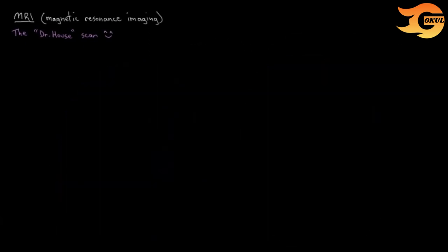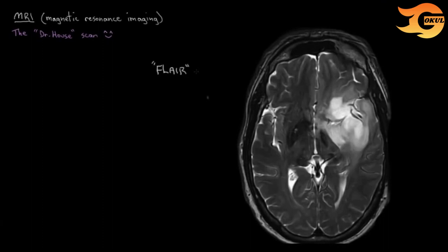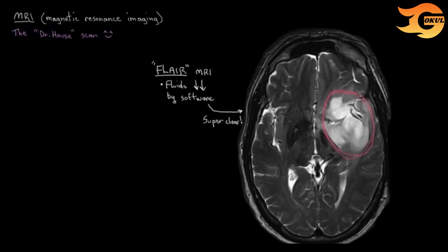The last image is another type of MRI called FLAIR MRI, in which pictures of the brain are taken but computer software removes any fluid from showing up in the final image. What you end up with is a super clear image of just the brain tissue. In this high-resolution, crisp FLAIR image, you can see there's a lesion — some damage happening in the left half of the brain. So those are some of the more important imaging tests in a stroke workup: CT, angiography, and MRI.